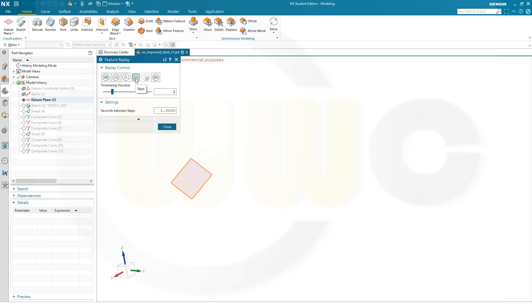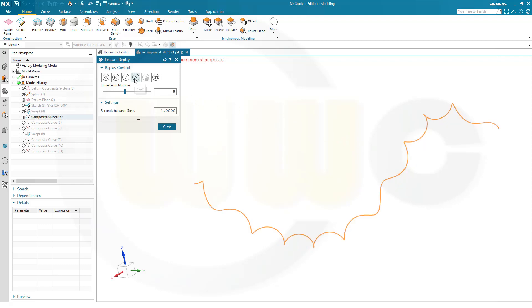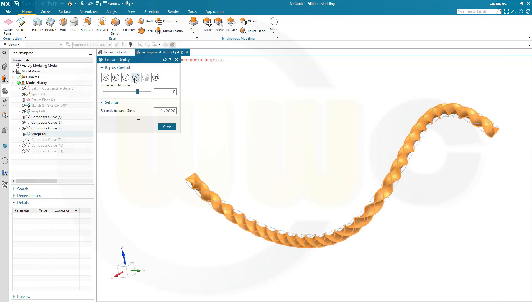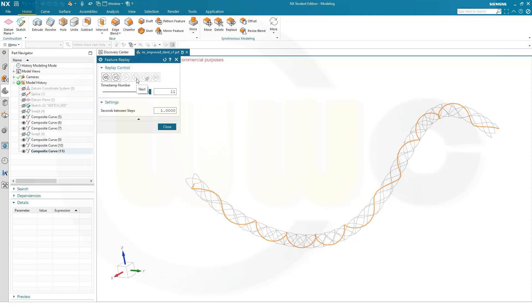On that plane I did a sketch and drew an equally sided triangle. Then I did a sweep with a rotation. Then I extracted the edges as composite curves three times, then did another sweep, but this time the turns were the other way round. And again, I did three extracts to get my composite curves.